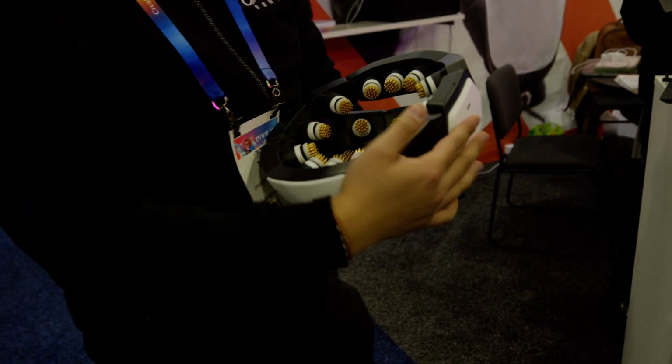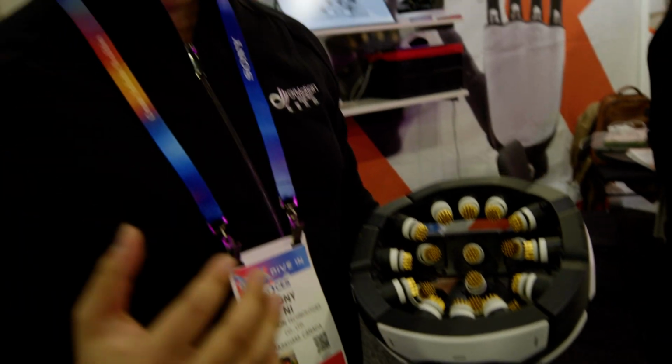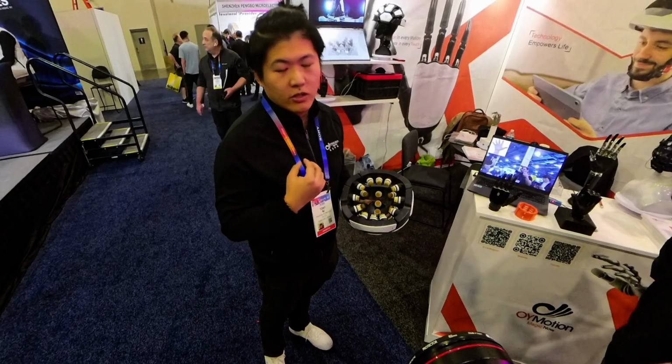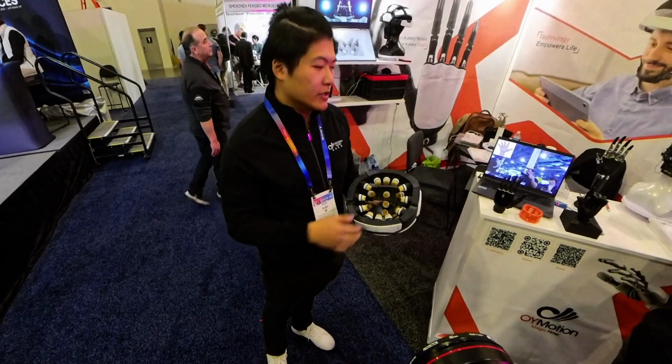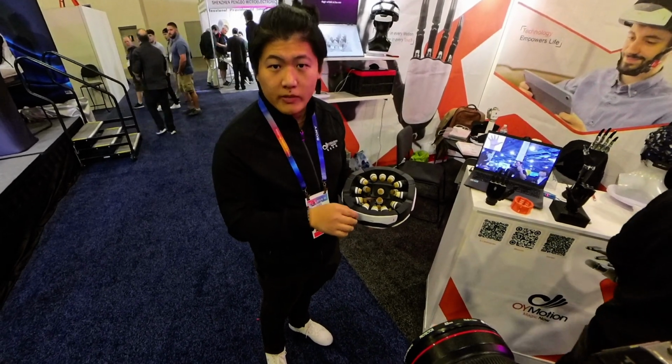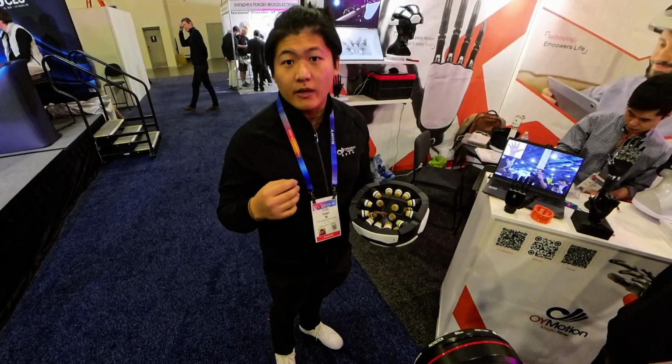What these are meant to do is capture your brain data, your electrical EEG data, and it tells you a lot of information about the brain. For instance, this series is meant to be a medical tool, and you can use it in a clinic or in the ICU, like a patient comes in with brain trauma or something like that. The doctor might need a quick brain imaging, and this can be used for that case.